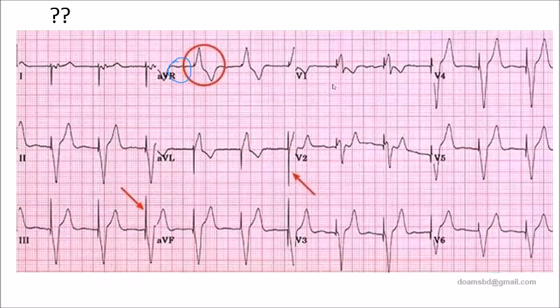This is the pacemaker. In which ventricle is a pacemaker usually placed, right or left? It is easy to place the pacemaker in the right ventricle. So this is a ventricular pacemaker. Clear? Pacemaker ECG, as a GP you must see, because patients come in the asymptomatic stage and show you the ECG. You cannot say otherwise. For that, I am showing this ECG. So this is a ventricular pacemaker.